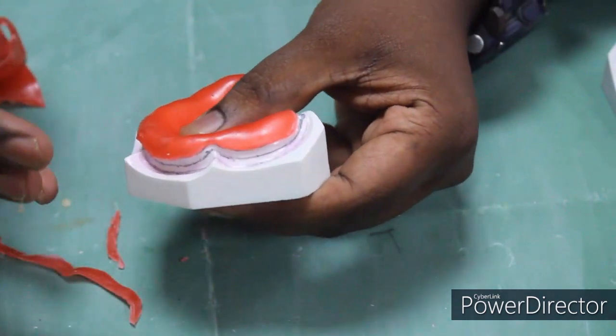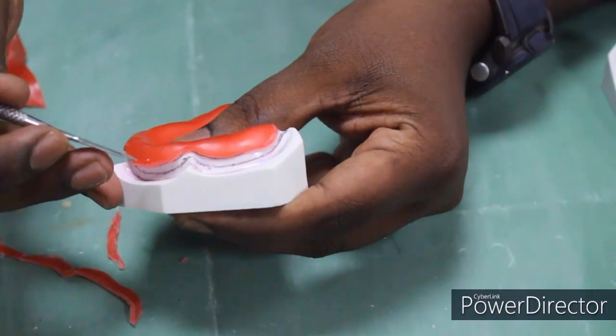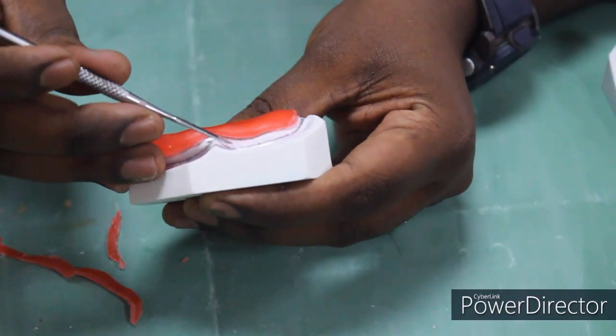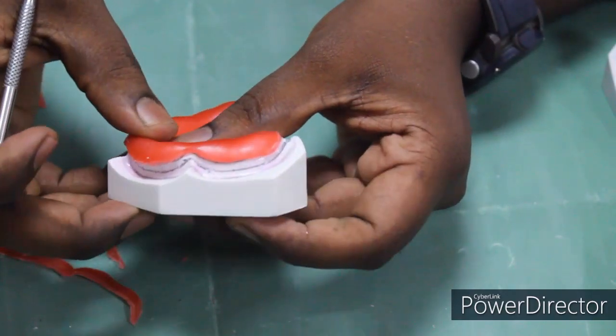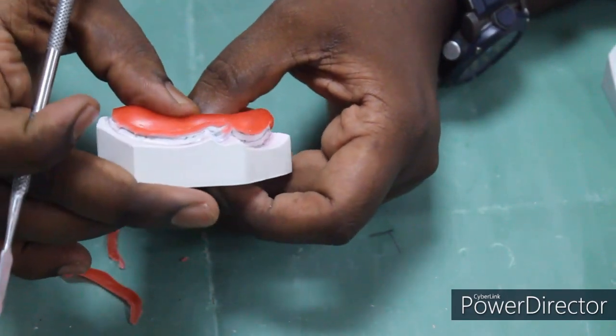Now you can see clearly there is a 2 mm short from the tray outline, that is from the second line it is 2 mm short. Like this you have to remove the excess wax.